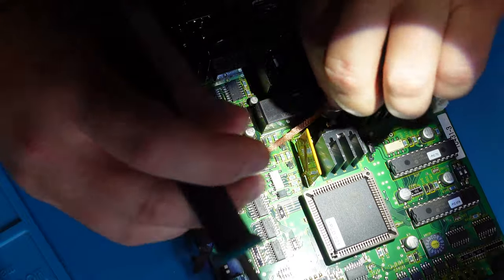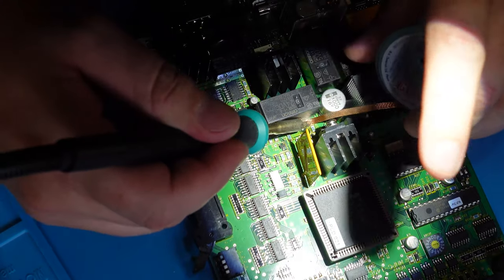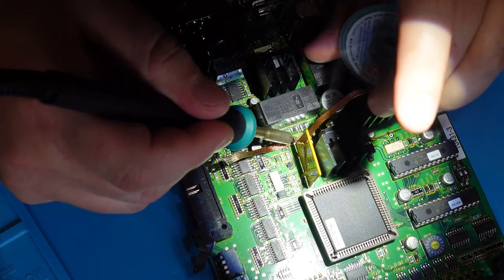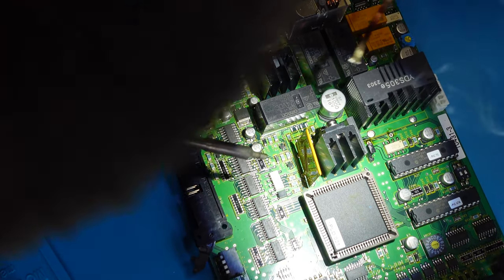All I gotta do is get the wick down on those pads and suck up the old solder. Boop, boop, boop. Just like that. Other side, boop, boop, boop. All clean.